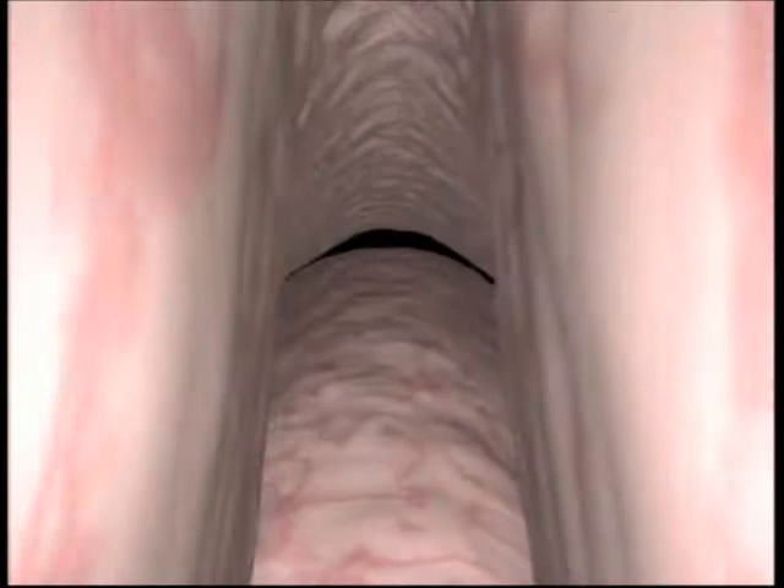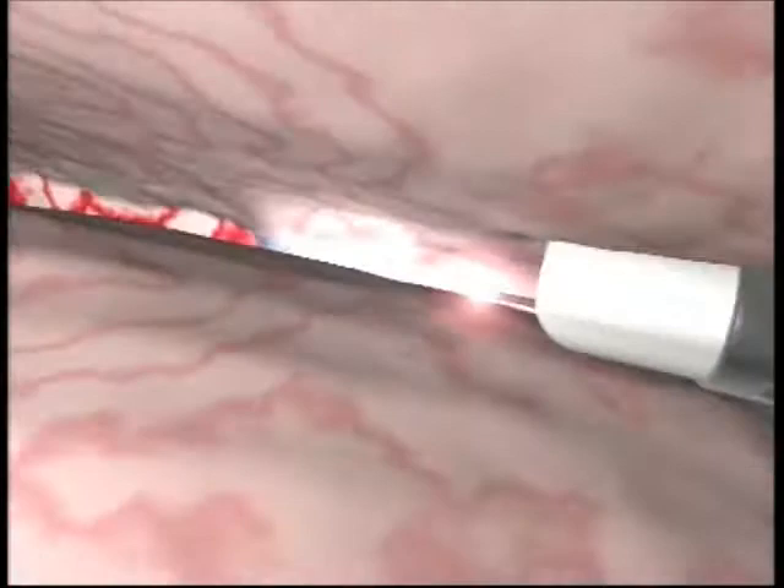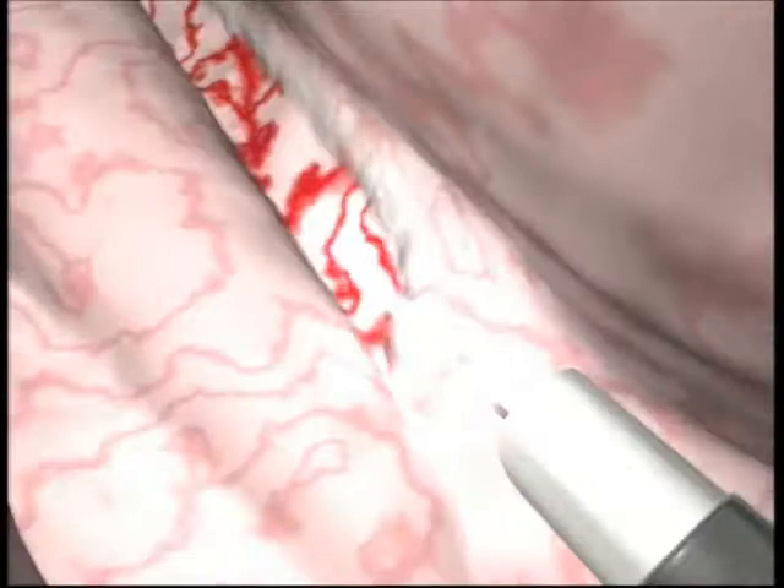Incisions are made at the 5 and 7 o'clock positions from the bladder neck up to the verumontanum. The incision depth is increased until all circular fibres have been divided in order to identify the surgical capsule of the prostate.